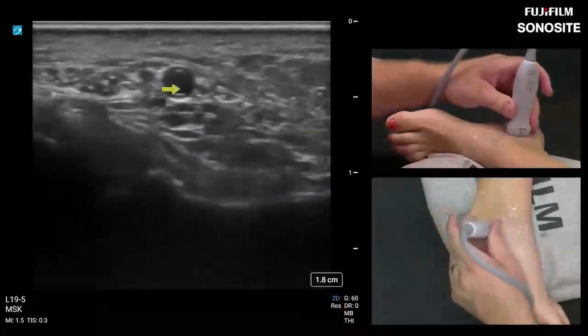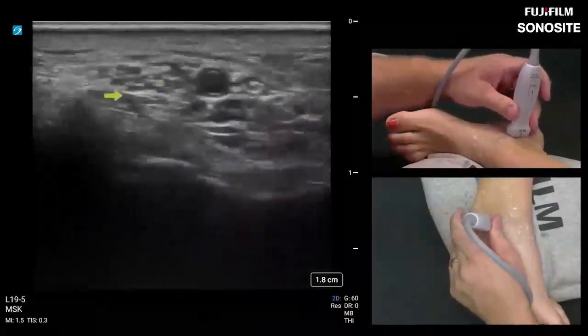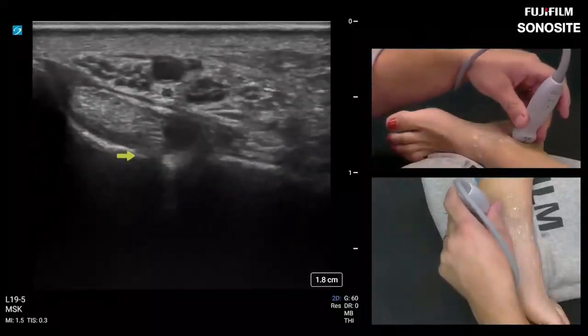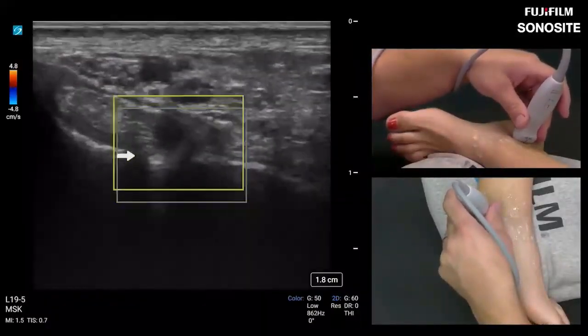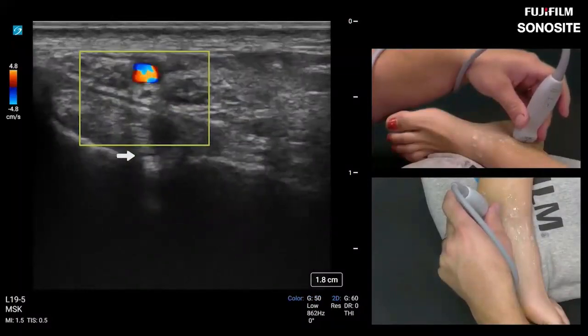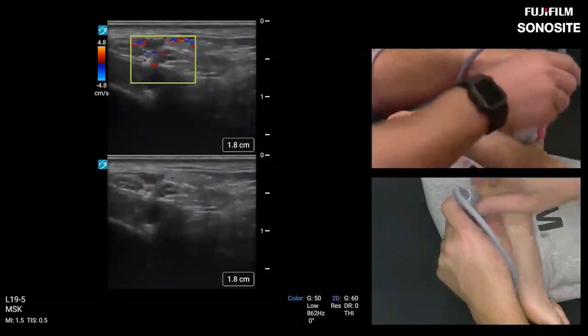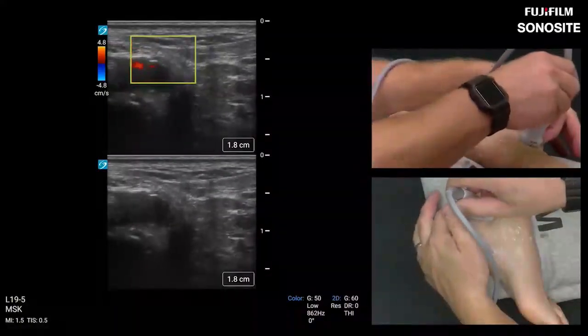If you're guiding procedures in this area, say to a posterior subtalar joint, which will be covered in a future lecture, it helps to have what's called the color compare tool on. So we can throw our color on and hit either the top bottom here, and we could be doing our procedure from the posterior aspect here, for example.